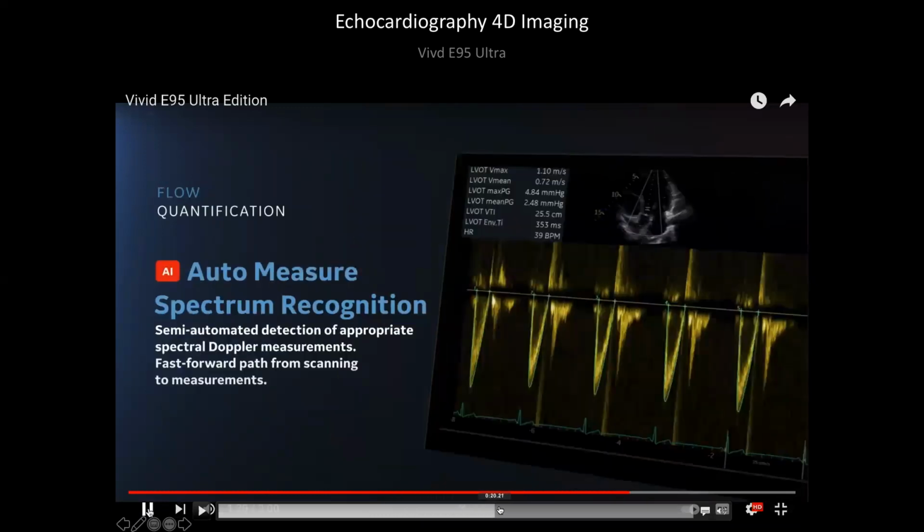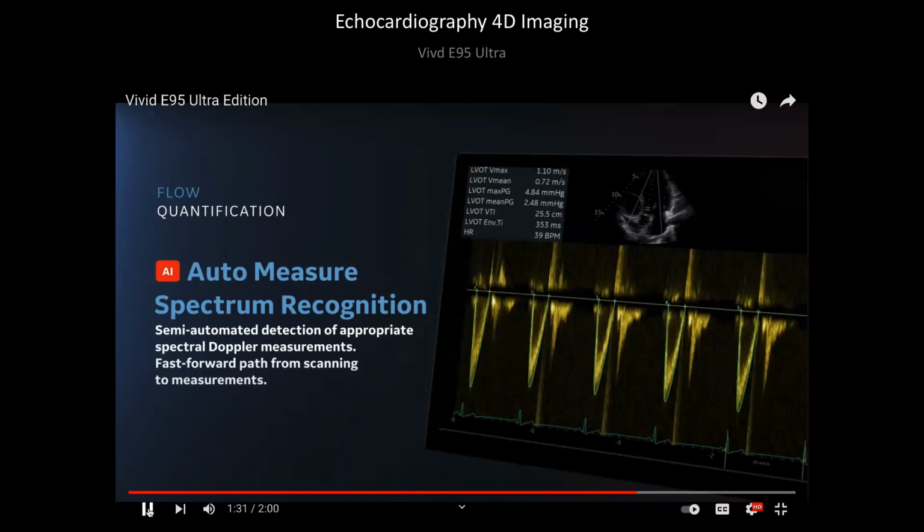So that's that. And then remember we were looking at these Doppler velocity spectra down this dotted line, right through the aorta, and you get these beautiful velocity spectra that on most machines now they make automatic segmentations of this data so that you can measure peaks, the derivatives of these curves, et cetera, and get mechanical information, which is what you'd want if you were trying to fill out that enormous table to figure out what stage people are at for aortic stenosis.